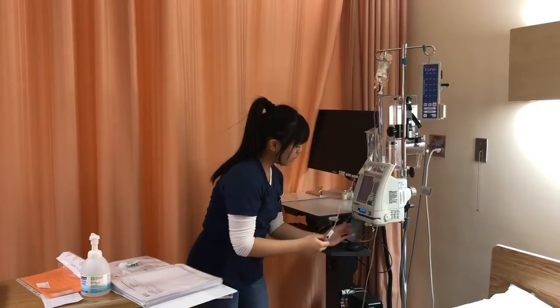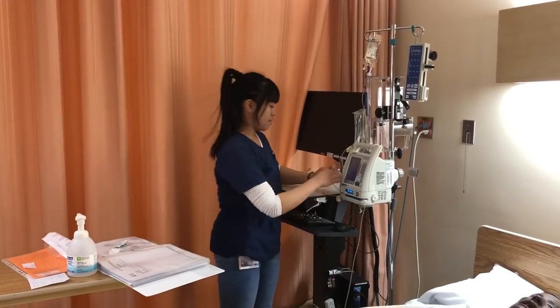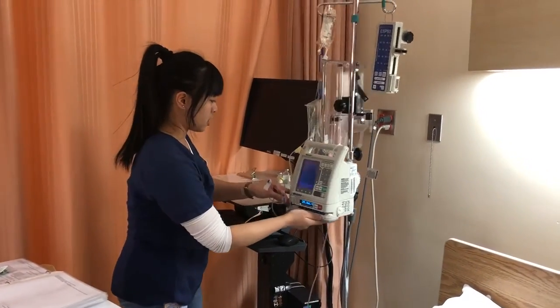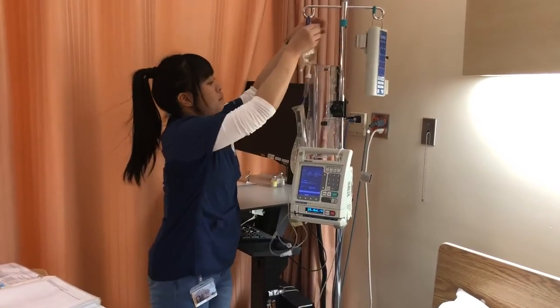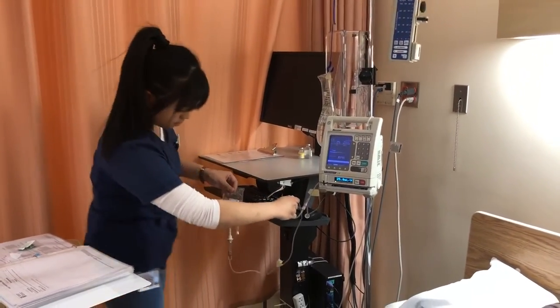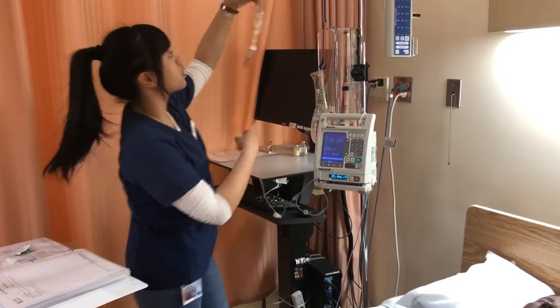And then I will be cleaning the port that is before the pump, so it will be regulated. So I'm just gonna clean that. 30 seconds has passed, and I will let it dry for 15. For video purposes, I'm just gonna verbalize that, and I will connect it in here in this port. So I'm just gonna show you that, like so. And then I will do my back priming. So I'm gonna slowly open the port, like so, and I will be doing it, filling it about halfway until no air is there. So there's no air in my tubing, so we're good to go.